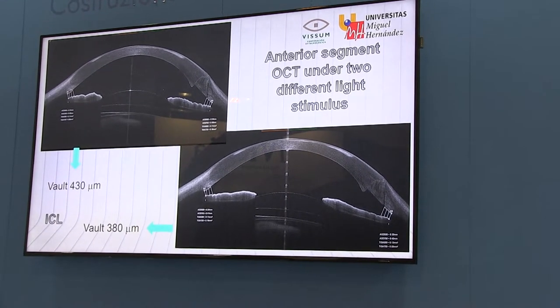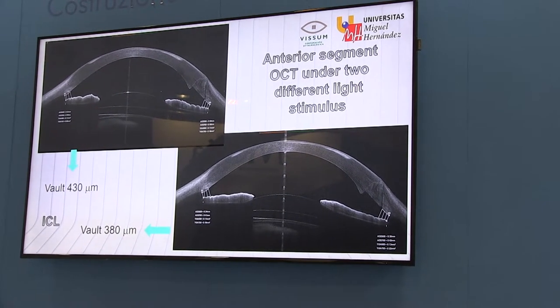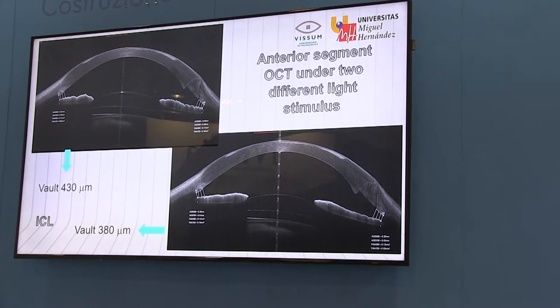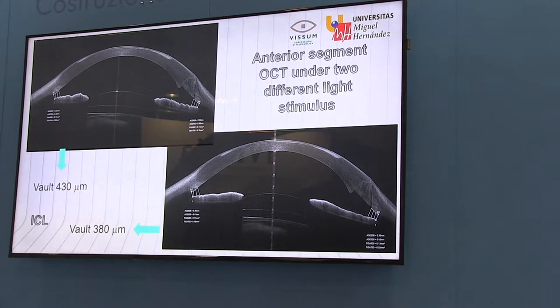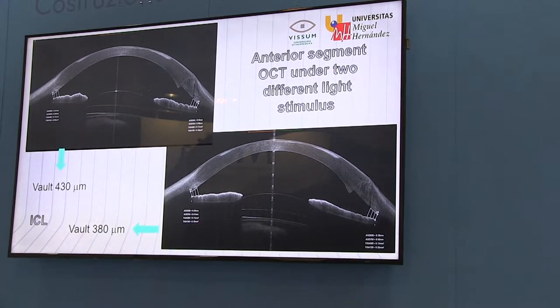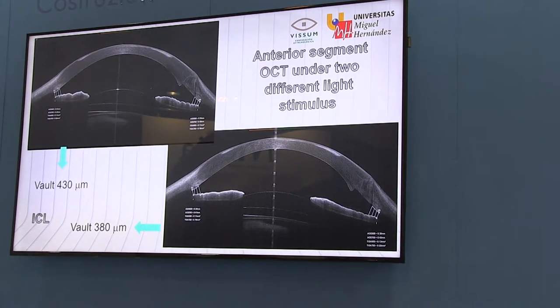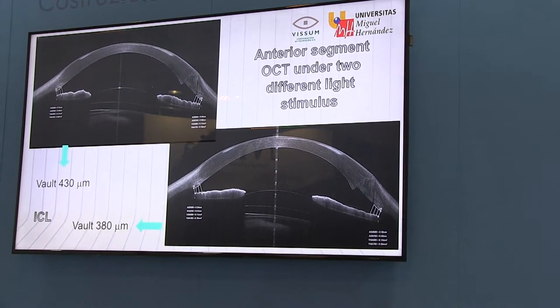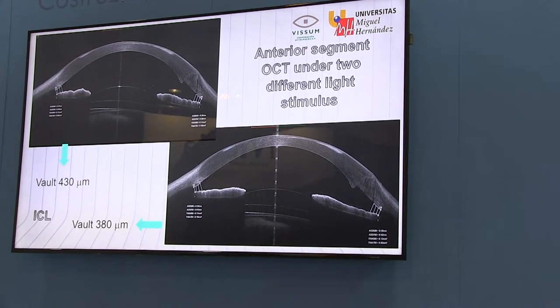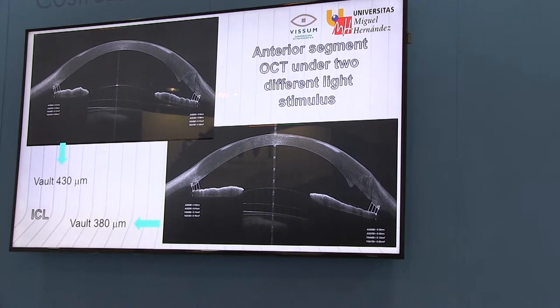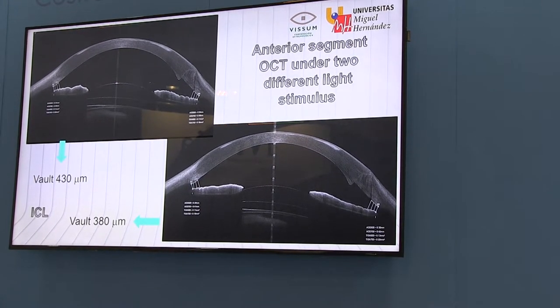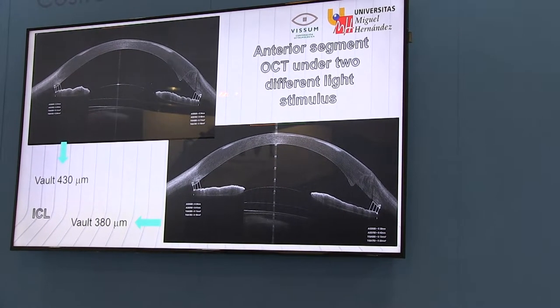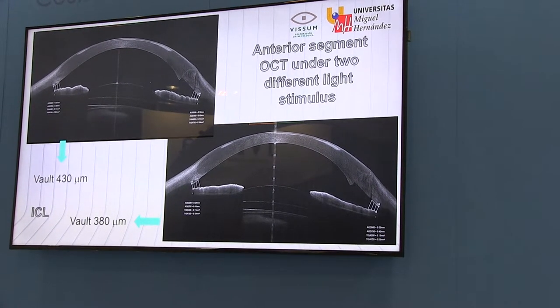You can see here other examples — this is an ICL, hyperopic. The vault here is good, and when the pupil is constricted it is also good. Even though the vault is decreased, it is still good enough not to have this problem.